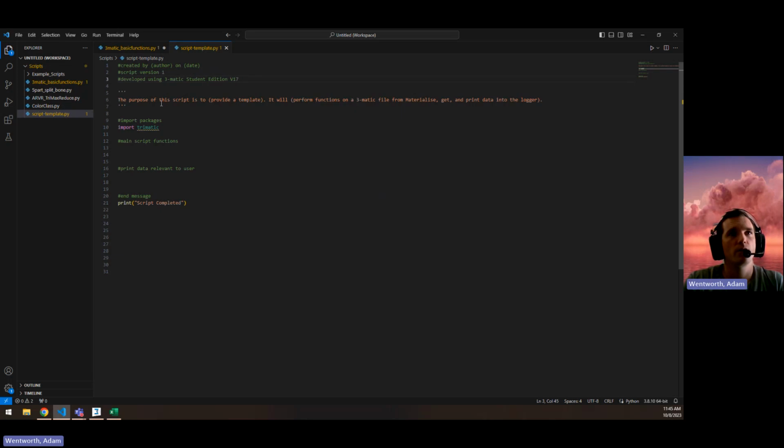Here we've essentially commented what is the purpose of the script, what are the inputs, what are the outputs, and what does it do, right? For any of the scripts that are developed for 3-matic, you have to import the package of Trimatic, which includes all the functions in the API.